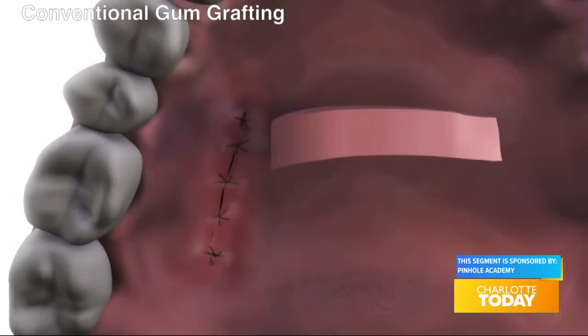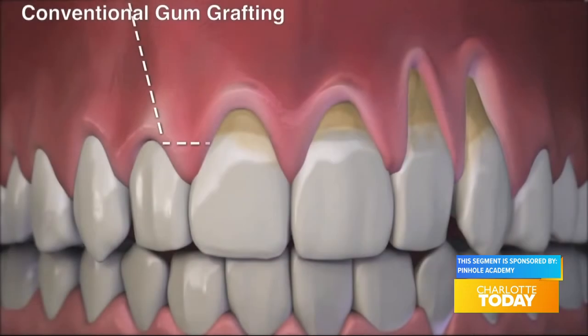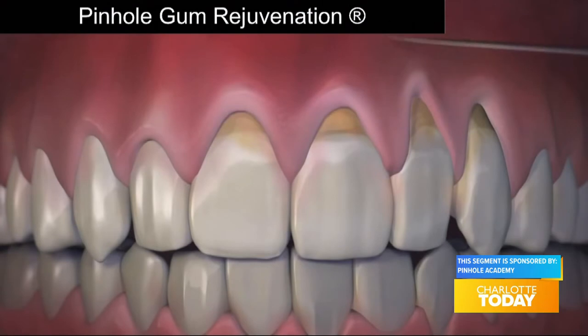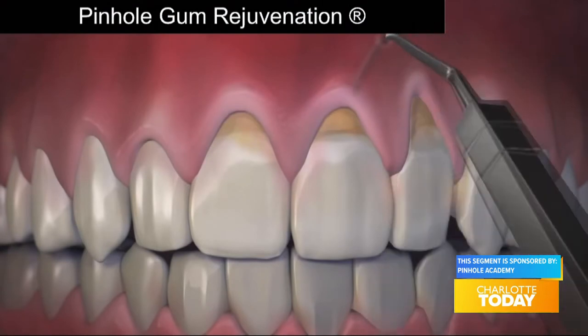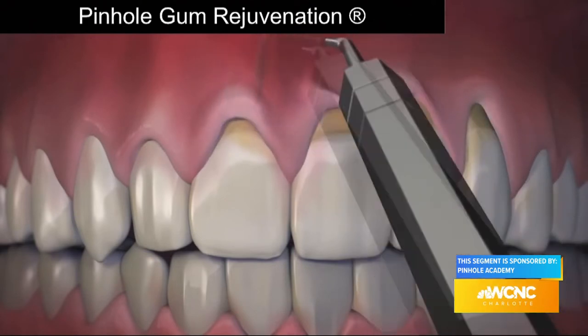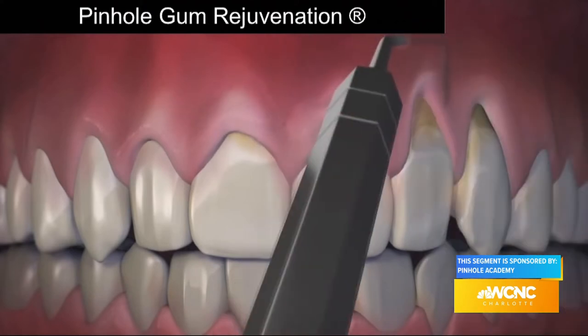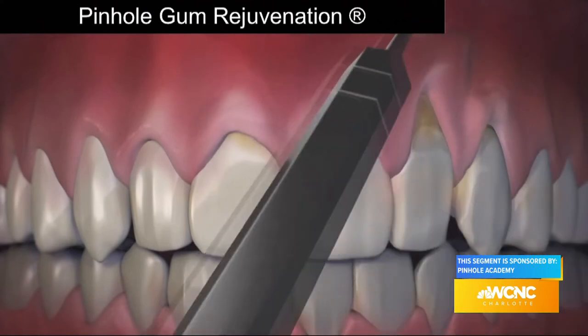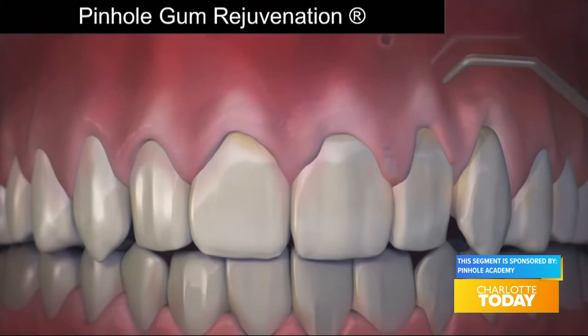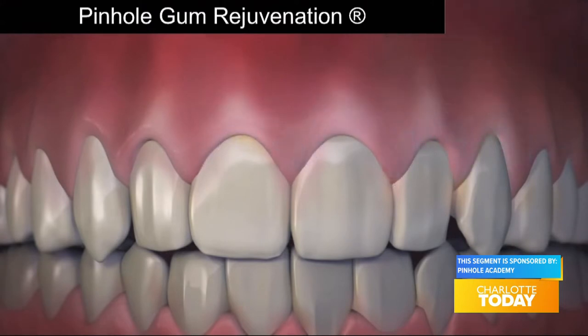How is pinhole gum rejuvenation done and how does it compare to conventional gum grafting? Unlike conventional gum grafting, pinhole is done with no scalpels, no sutures, and requires minimum downtime. The entire procedure is done through tiny pinholes made in the gums. First, the gum tissue is numbed with a local anesthetic. Then, using special instruments that I designed, a trained dentist frees the gum tissue and guides the gums down to cover the exposed roots. The pinholes heal quickly, and most patients report little or no pain and require virtually no downtime.